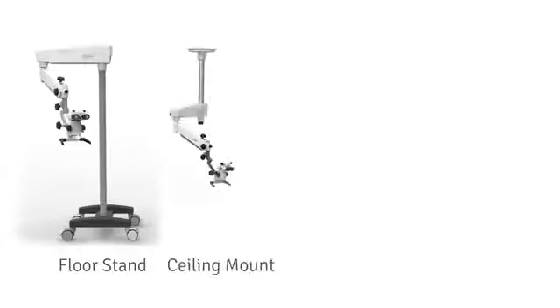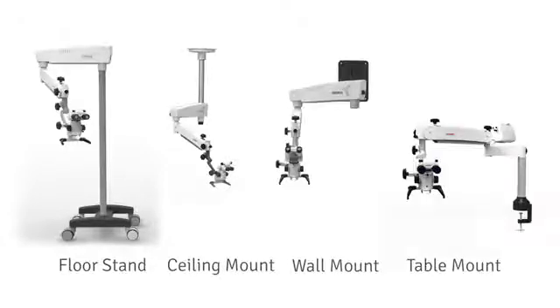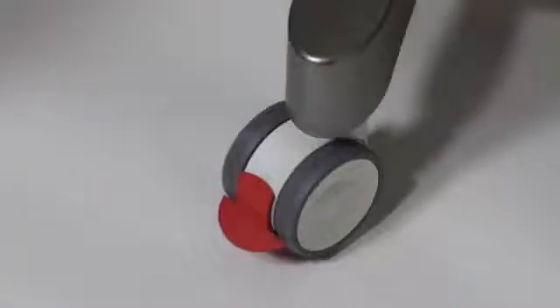The Prima comes with four essential mounting options: floor stand, ceiling and wall mount, and a table top mounting is available for the trainer model. The floor stand option comes with an H-shaped base built for stability and mobility on medical grade lockable caster wheels. The locks are designed to easily engage and disengage.